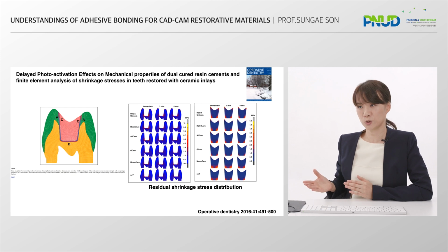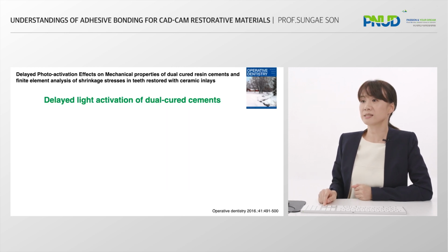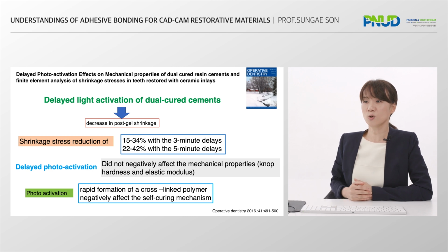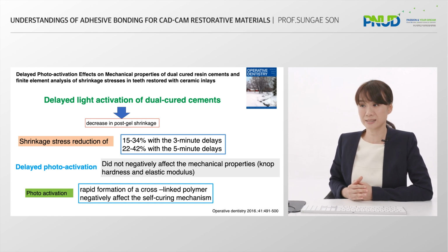that have been introduced to dentistry. One of them is the delayed photo activation technique. This article said that a delayed light activation of dual cure cement decreased the post-gel shrinkage. Moreover, delayed photo activation did not negatively affect the mechanical properties of the resin cement.